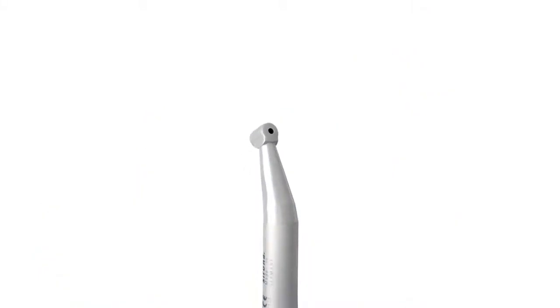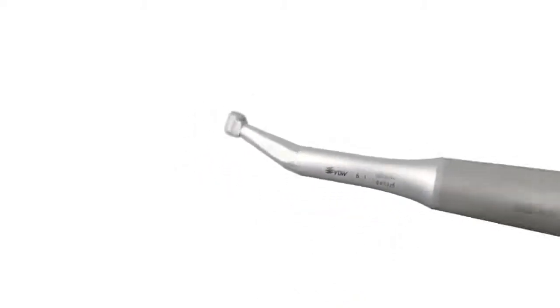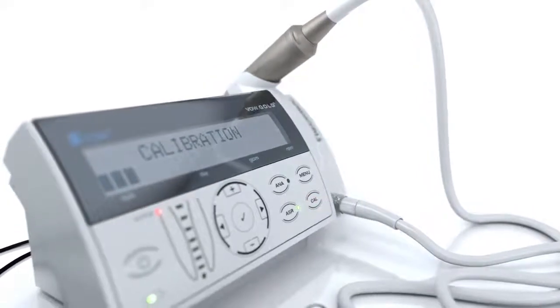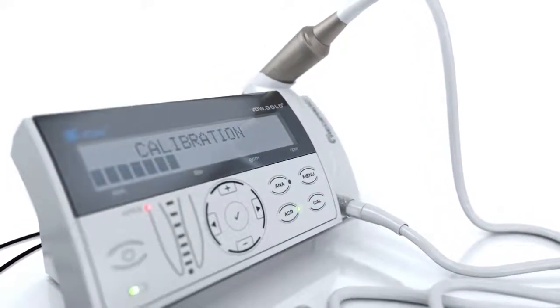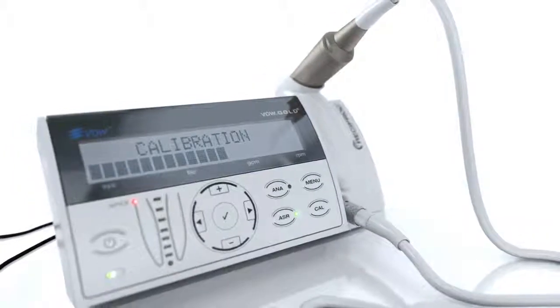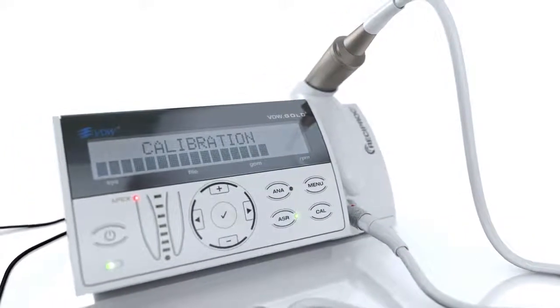After proper care and maintenance, the contra angle can be put on the micro motor. Then press the CAL key. The calibration is important to ensure the contra angle's torque accuracy. The contra angle needs to be calibrated every time it is put back on the motor.